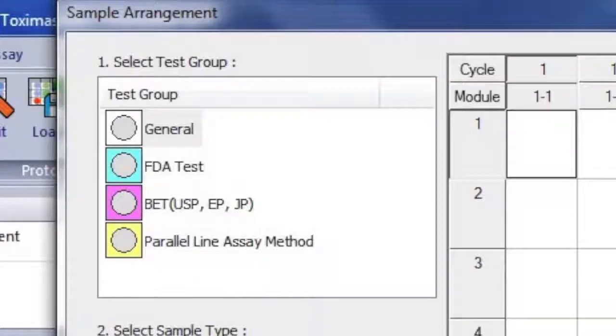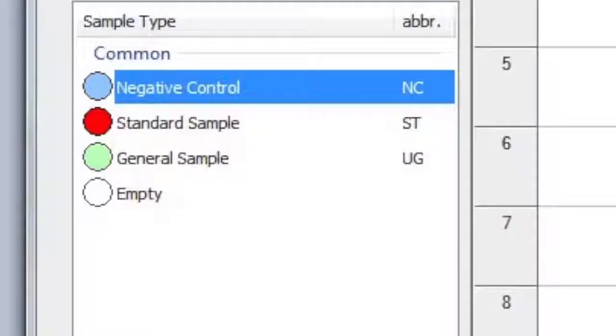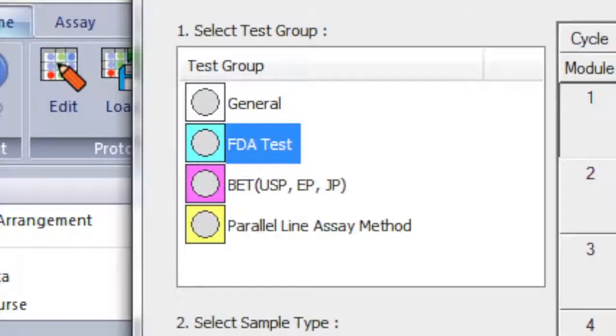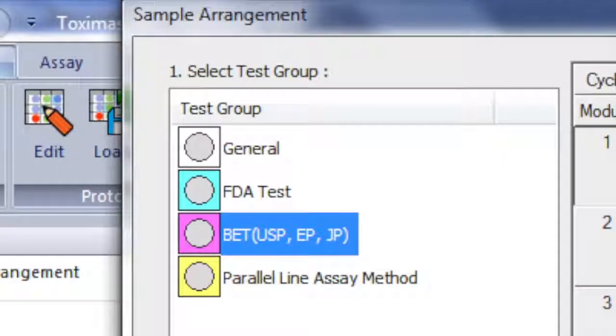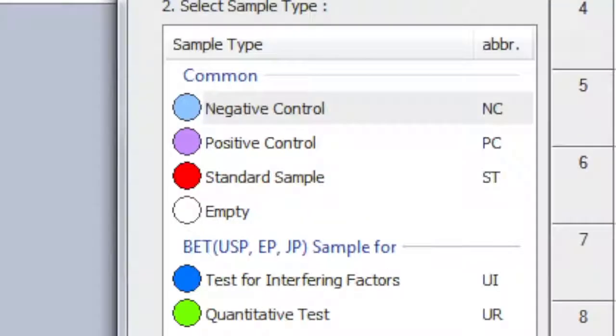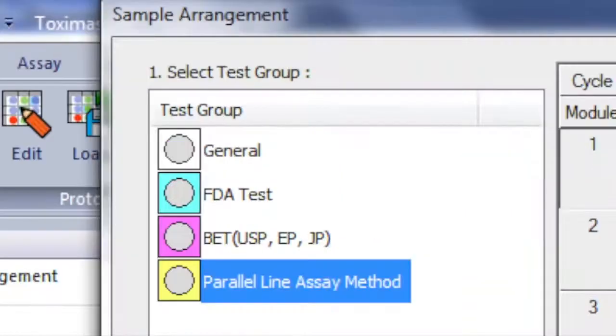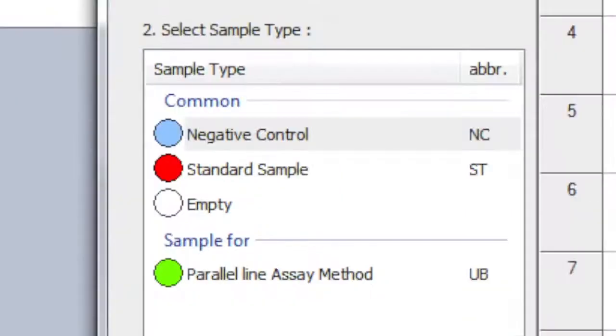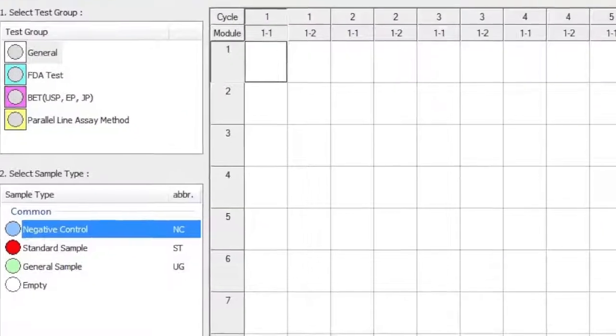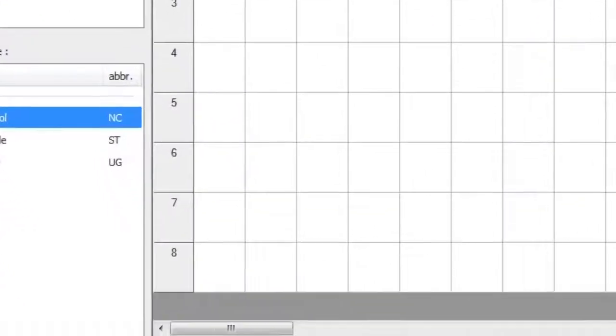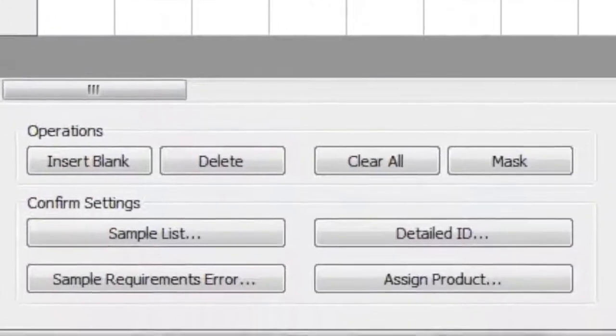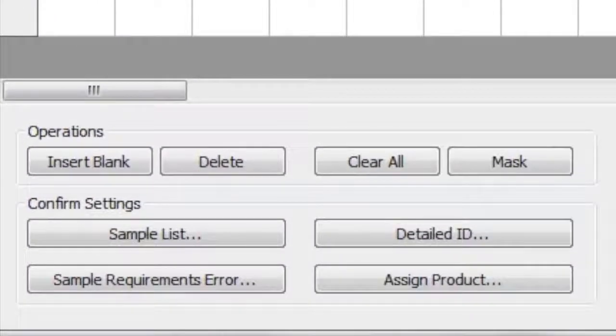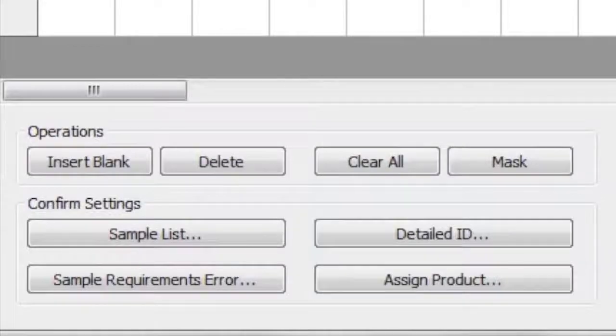There are four test group options to select from. Within the General Test group, there are Negative Control, Standard Sample, and General Sample options. The FDA test group includes additional sample options. The B.E.T. test group includes these additional sample options. And the Parallel Line Assay method includes this additional option. At the bottom of the Sample Arrangement box, you can find various options for customizing the information about each sample.